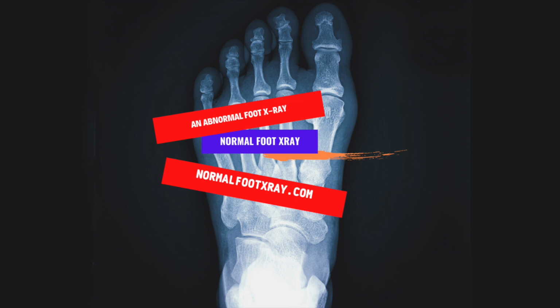The X-ray of a normal foot is characterized by the presence of the medial cuneiforms. The first toe is clearly visible. The other toes have normal alignment. The sesamoid bones are in yellow and orange, respectively. In both types of foot X-rays, the medial cuneiforms are well visible. The joints in the metatarsophalangeal joint are well aligned.